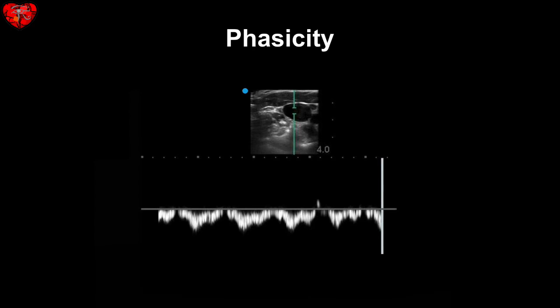Not only is venous velocity lower than that in arterial tracings, here you can see another typical Doppler signature for veins: phasicity. This is the undulating tracing that relates to the changes in intrathoracic pressure. This occurs with normal breathing and is typically seen in larger veins, such as the internal jugular vein, which is shown here.